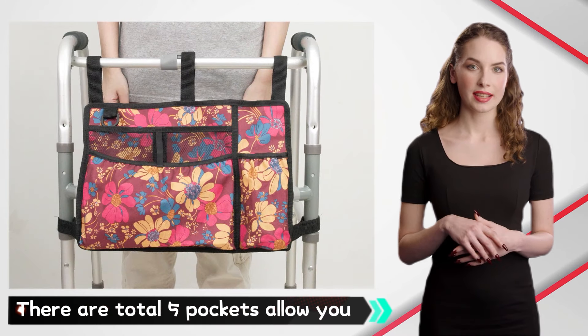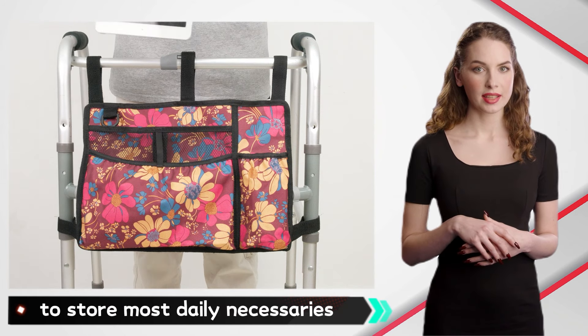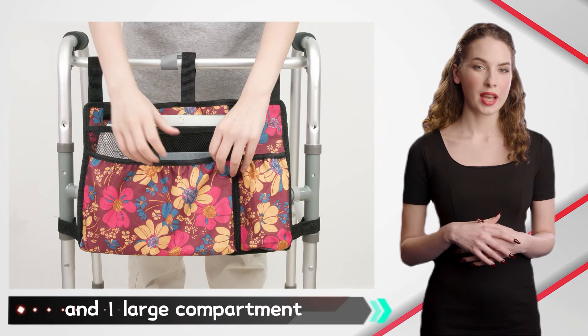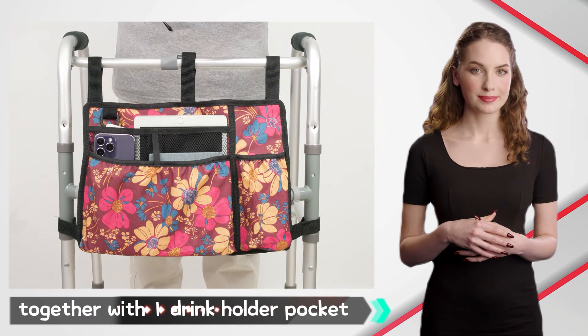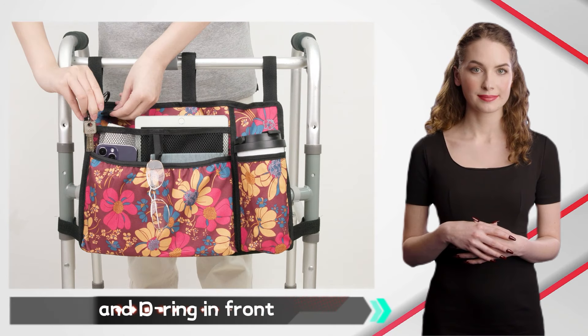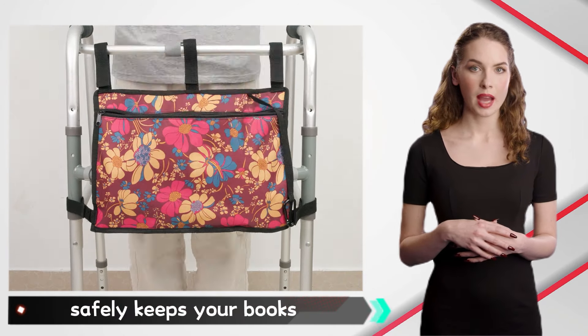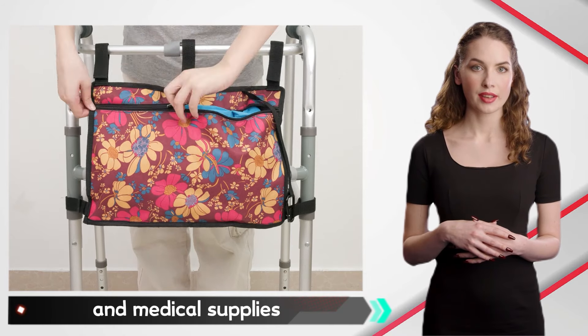There are a total of five pockets, allowing you to store most daily necessaries: two mesh pockets and one large compartment, together with one drink holder pocket and D-ring in front. One large zipper back pocket safely keeps your books and medical supplies.